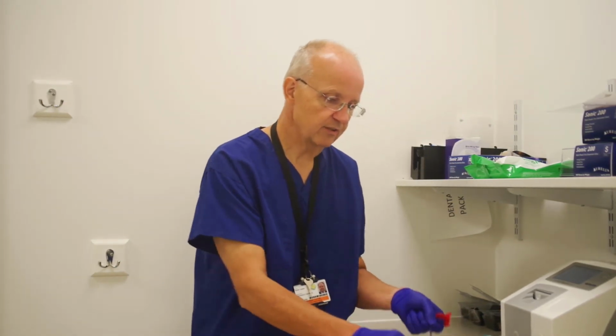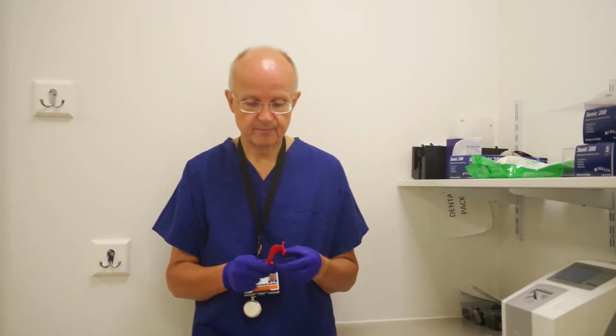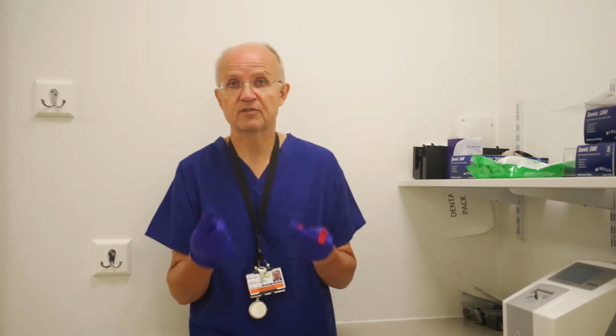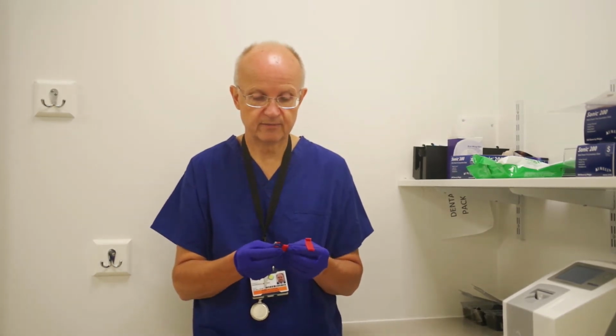Okay, so now we're just going to set this one up. We're going to set the adult one up. Dead easy, we do this exactly the same way whether it's left or right. And of course, because it's a bite wing, you don't need to think about upper or lower, because we're looking at the crowns of both teeth.